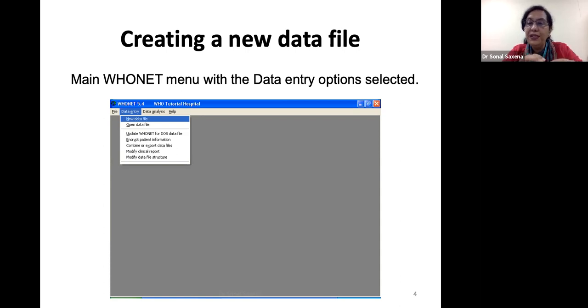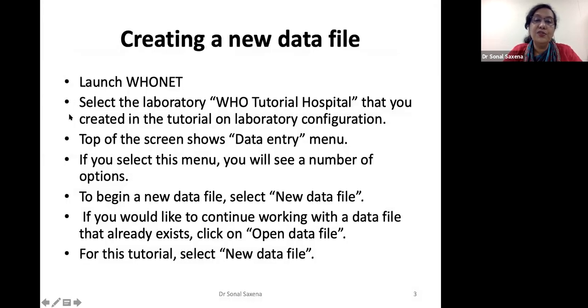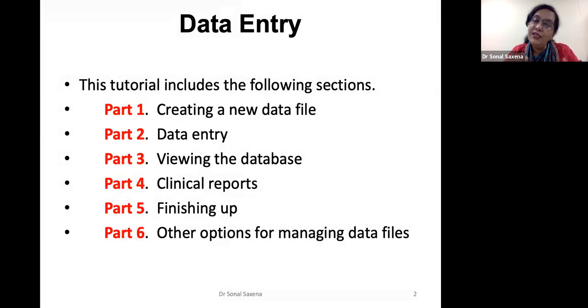It's in the form of PDFs, chapter one, chapter two, chapter three. What I have done is that I have made a PPT out of it and added my own pictures while doing the entry. And this is the only thing which is different. So every time you have a teacher built in your WHONET to teach you everything. And these tutorials and these PPTs are all made from those tutorials which are there in your help section.